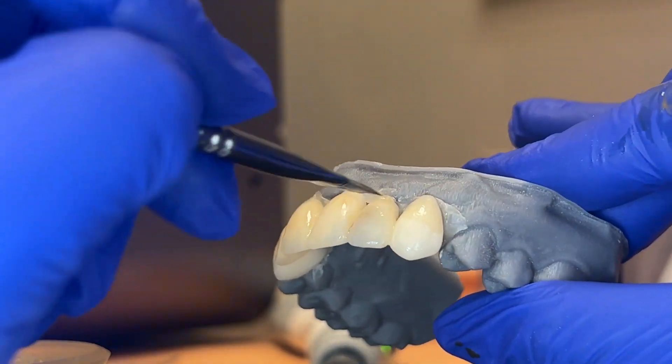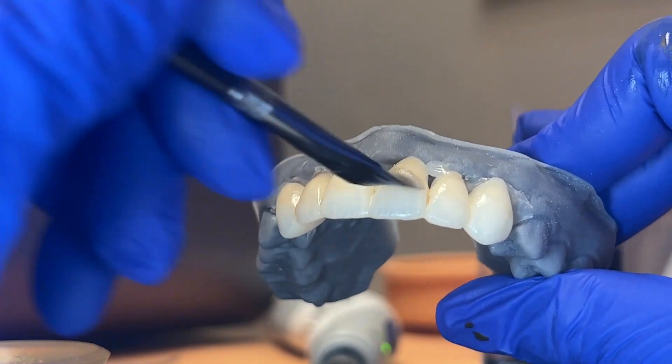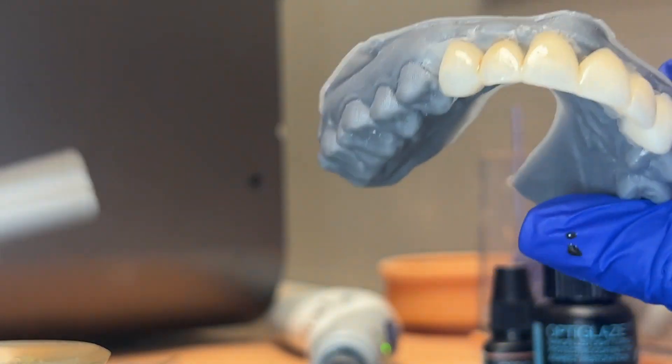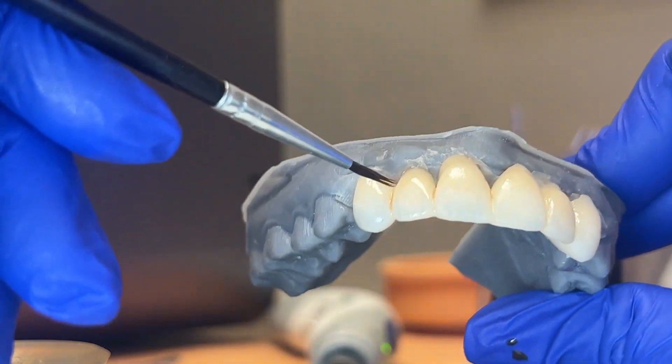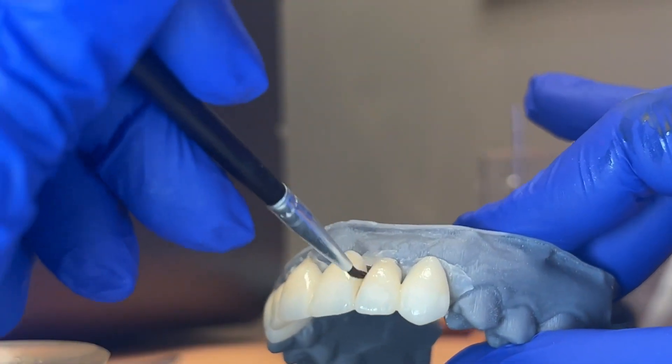If I had margins underneath here I definitely wouldn't be this sloppy, but because I know that's wax underneath, that's fine. I'll do the same thing again — take anything that got into the embrasures and clean it out.